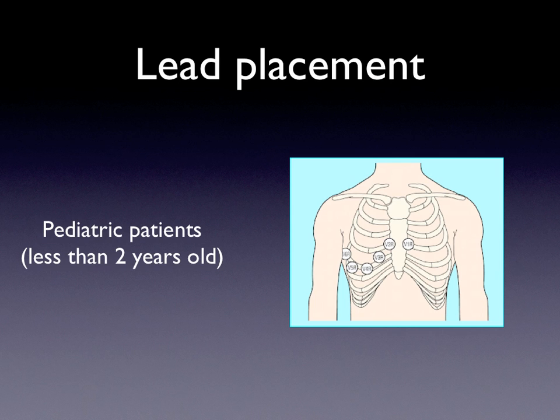But if you're in a practice, or let's say you get a job in a hospital with children or with pediatric patients who come in for more complicated conditions, you might see this. And again, this is right out of the study guide for your national certification test. So again, pediatric patients less than 2 years of age may get an order for a special right-sided 12-lead EKG.